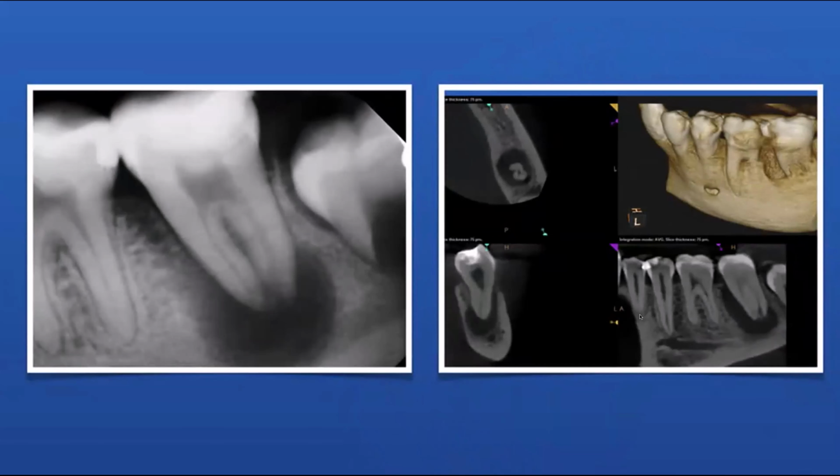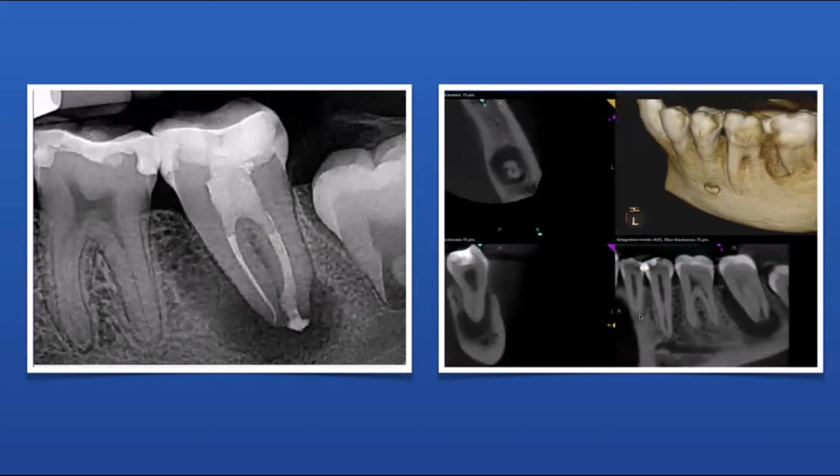Pre-Gentlewave, Miller would have done this case in 2 visits or more. I would have waited to see some type of favorable result. This is my final result. The mesial canals were instrumented to a 15/04. The distal canal was wide open. I packed that with MTA in the apical third in one visit.